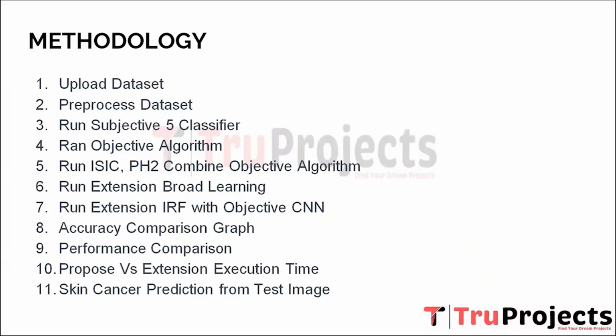Eleventh, skin cancer prediction from test image. Finally, the system puts the prediction model to the test by using a test image not previously seen in the training dataset. It processes the test image through the most accurate and efficient algorithm, generating a prediction indicating whether the skin lesion is benign or malignant.